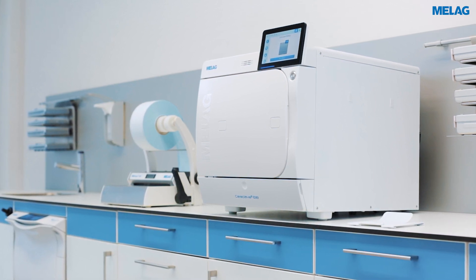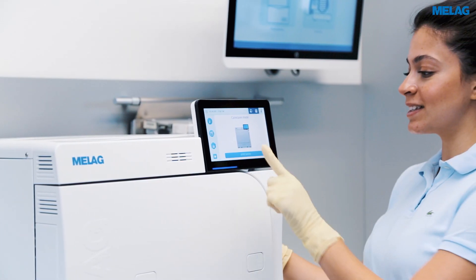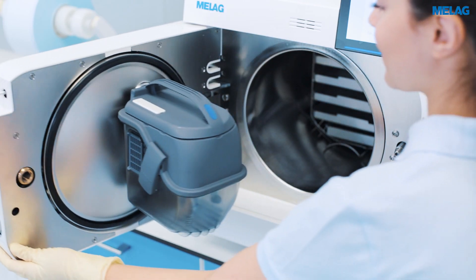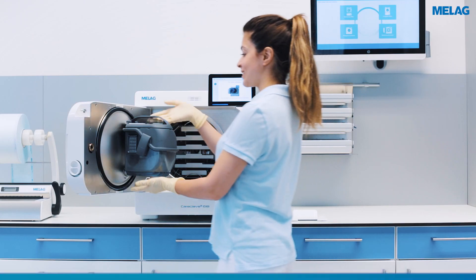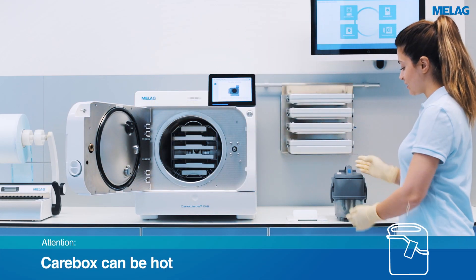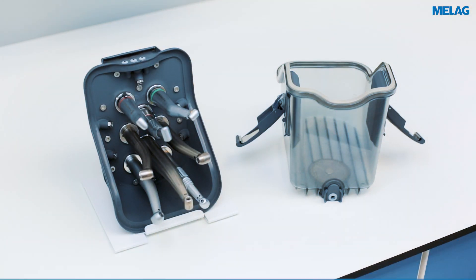CareClave offers optimum care for your valuable instrument. All hand pieces and turbines in the Carebox blue are lubricated with high quality dental oil as part of a care programme. The chuck care function also protects instrument heads from wear.